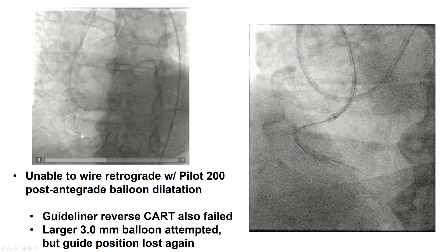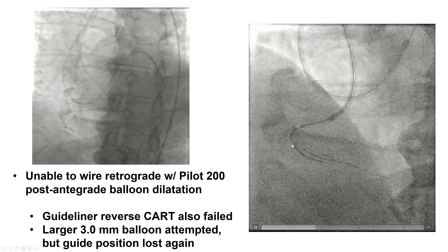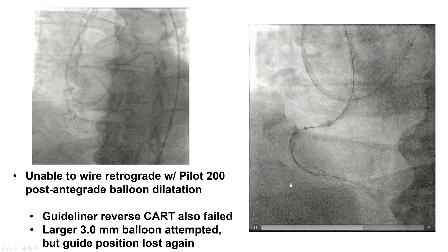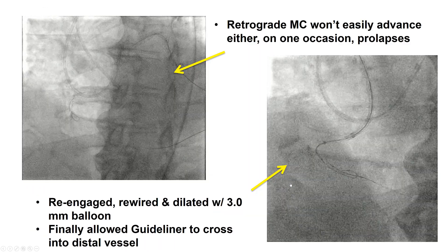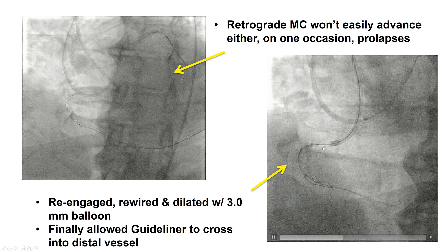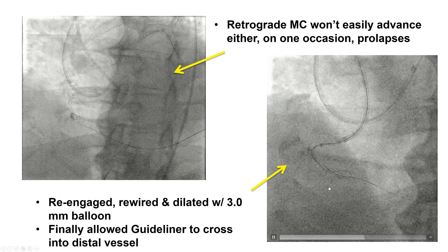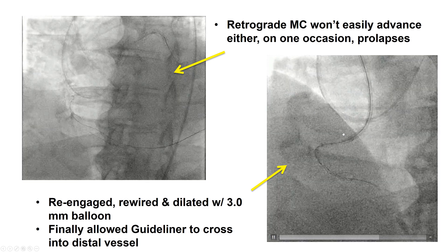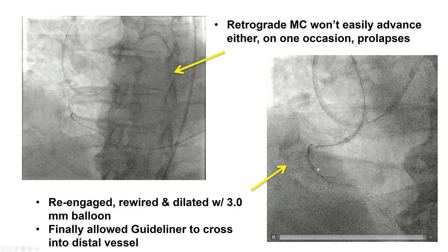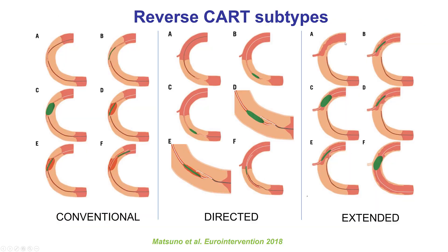We had an antegrade knuckle and tried to cross retrograde but it didn't work. We advanced a balloon in the mid-right coronary artery — up to a 3.0 mm balloon — that didn't work either. We decided to change the location of re-entry using the inch-worming technique, and we were able to advance the GuideLiner from antegrade all the way down to the distal right coronary artery, providing a better target for our retrograde equipment. This effectively switched us to what's called an extended reverse CART, going distal to the occlusion to re-enter close to the distal cap.